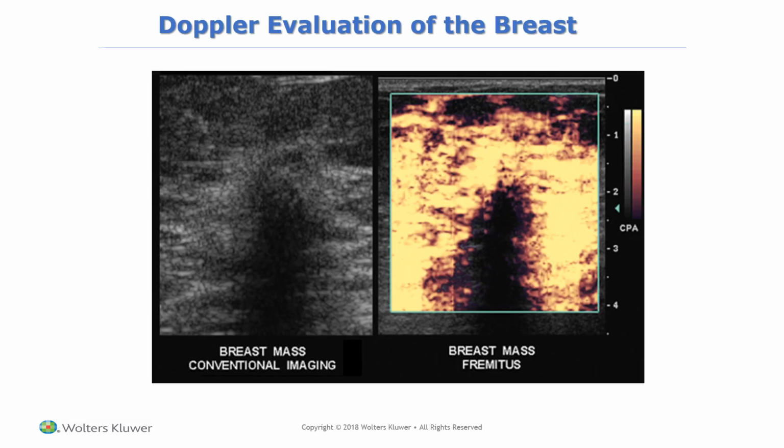So here's an example of a patient, just a regular B-mode imaging on the left, looking at that breast mass. Obviously, it's shadowing, but perhaps the tech is wondering if it's scar tissue or something else. So they had their patient make the vocal fremitus noise and put color on at the time, and all of the mobile tissues are going to move, creating that Doppler response, whereas that adhered solid mass is going to stay very still, creating this ability to identify the solidity and the adherence of that mass.